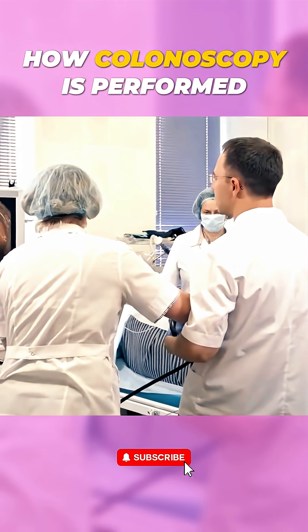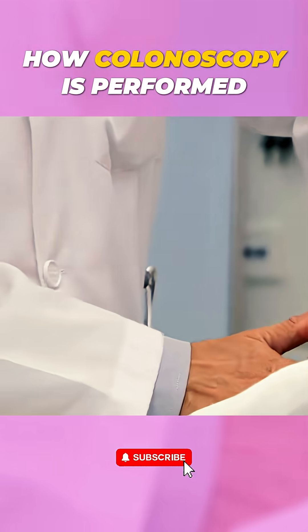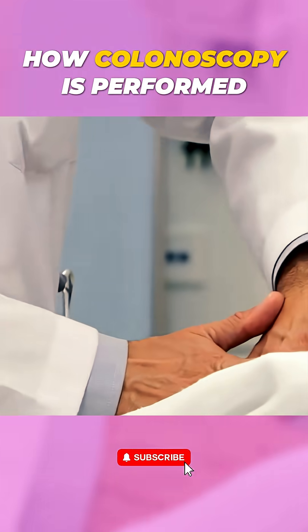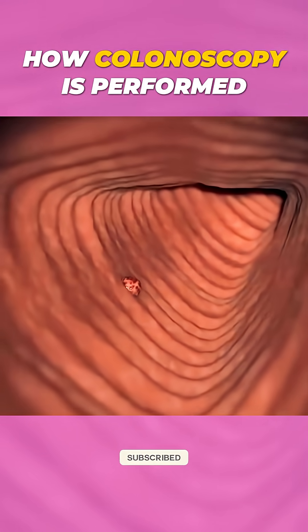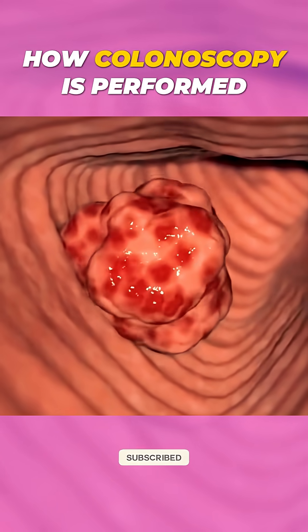Most patients can go home the same day, but they might feel bloated or experience mild cramping. Recovery is usually quick, and results are discussed with your doctor soon after. A colonoscopy is one of the best ways to detect colon issues early, including cancer.